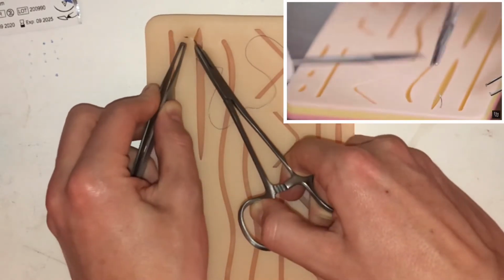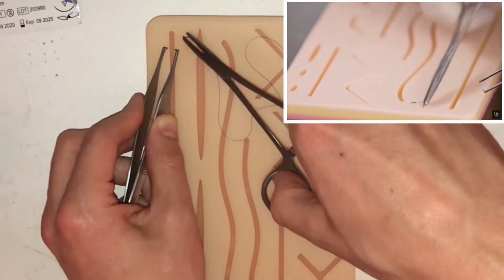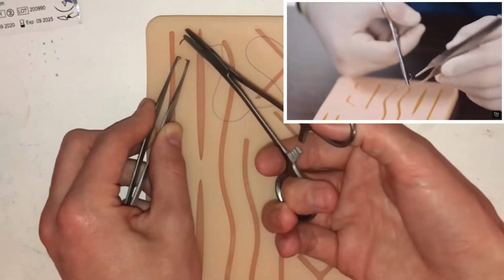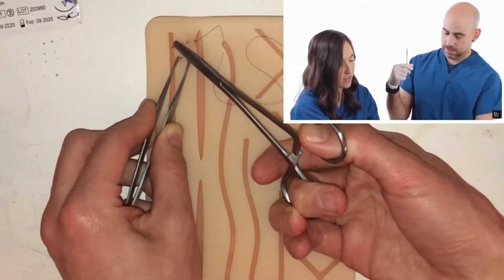Because you don't usually want to touch the tip of this needle because you don't want to either break it or make it dull. So now what you're going to do is protect your needle. That's it. Perfect. Pull through. Good. And now you're ready to tie.